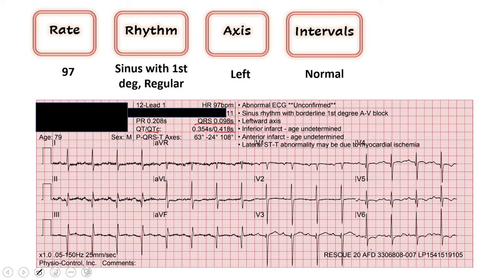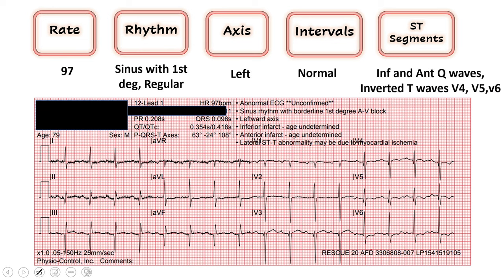Lastly, we get to look at our ST segments. We'll do this the same way every time. We look at 2, 3, AVF — these are our inferior leads — and I'm looking for any ST elevation, T wave inversions, anything that would suggest ischemia. I almost think I see just a subtle bit of ST elevation here in lead 3, but I don't really see it in AVF, so it doesn't quite meet STEMI criteria — it's not greater than one box, but it caught my eye. As I move to the high lateral leads, it's pretty steady across the baseline there, but this T wave is inverted in AVL, which always is a reminder to look at your inferior leads. As we move to the septal leads, I don't see any ST elevation or T wave inversions there. But as I move over to V4, V5, V6, we do have T wave inversions here — no depression really of the baseline, but T wave inversions, which can be an early sign of ischemia.